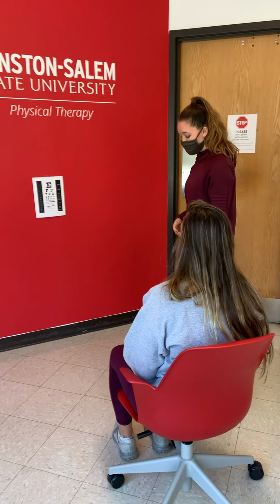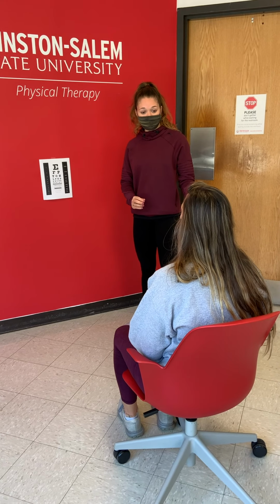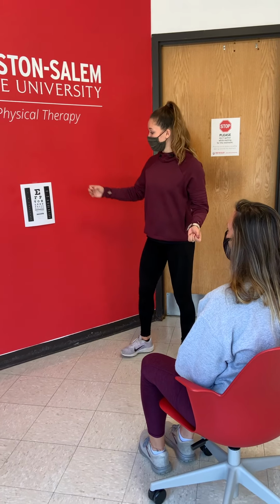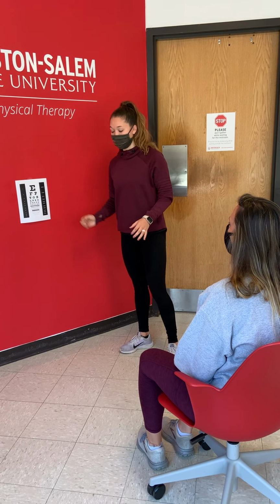Okay, so I want you to get at a distance to where these last two lines are blurry. Are you at a good distance right there? Yeah. Do you need to adjust at all? No. Okay, I want you to read from the first letter down as far as you can, and I'll be making sure that you have the right letters.